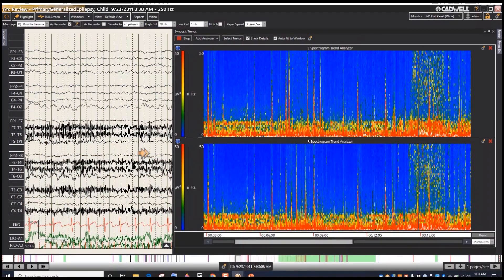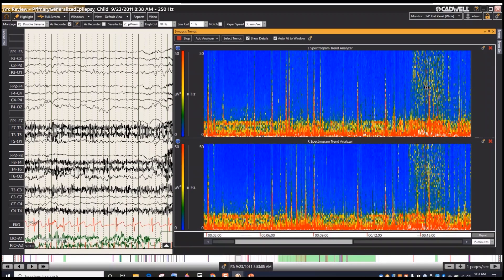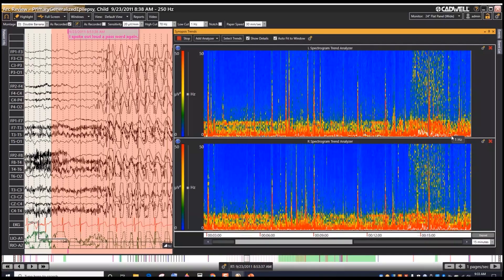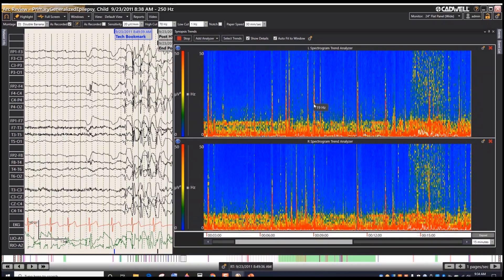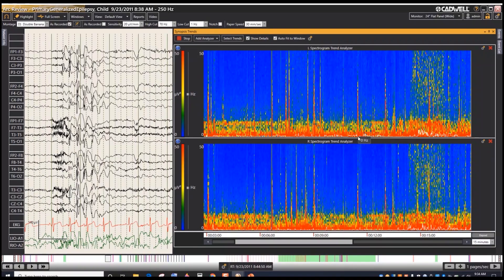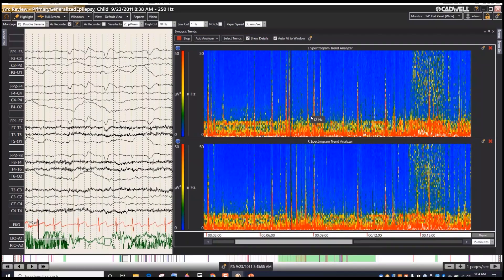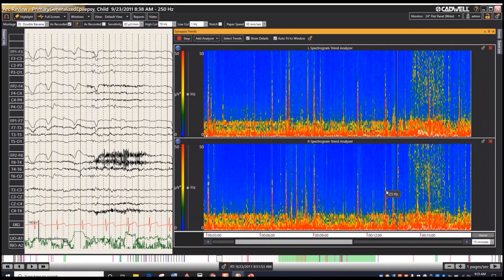This next example shows a patient with generalized epilepsy — a 30-minute recording, zeroed in on a short segment. You'll see several peaks in the trend and notice they look different. Some are clearly artifactual, except for one peak within there where you see a striped waveform. That striping is similar across several other peaks. Peaks without that nice stripe are artifact. So when we see that striping, we can make a reasonably good judgment that there's seizure activity.